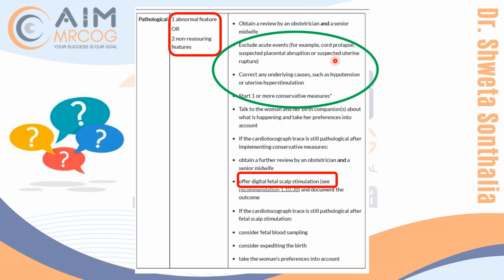Sudeep, in hyperstimulation, it's not necessarily always that the fetal heart will be abnormal. I'll be coming to that slowly. But with hyperstimulation, it could be a normal fetal trace or it could be an abnormal fetal trace. It could be both. So it can present in both ways.